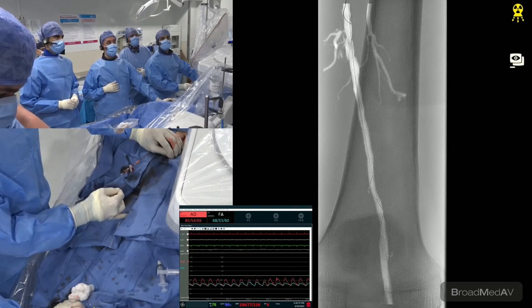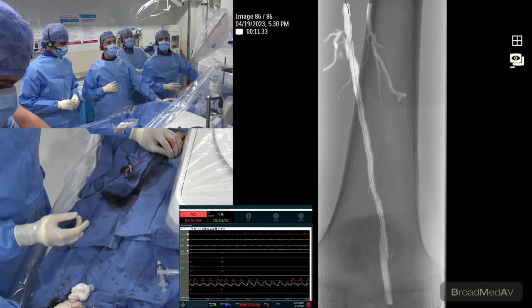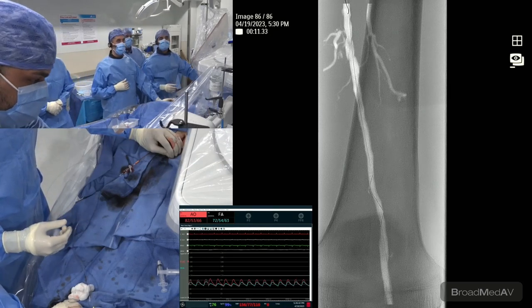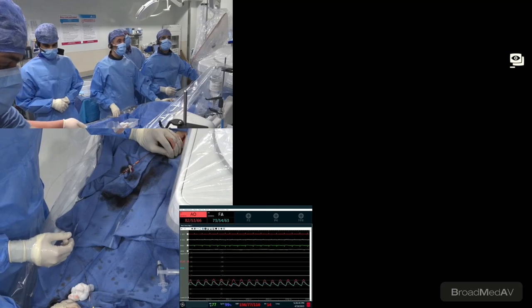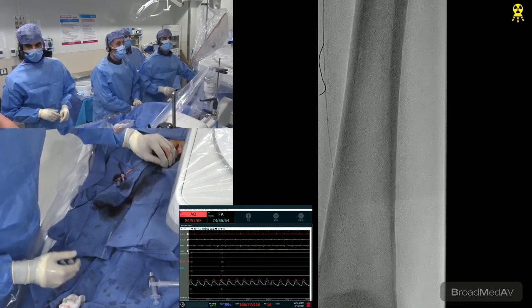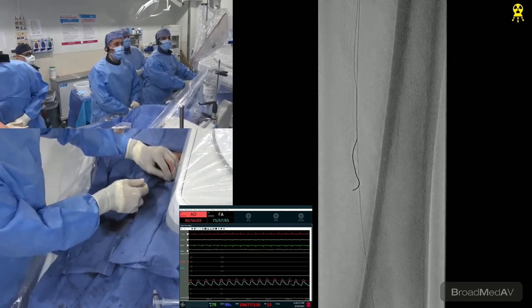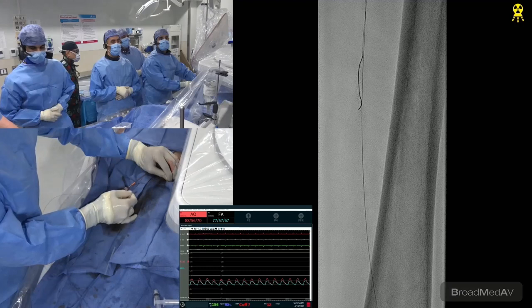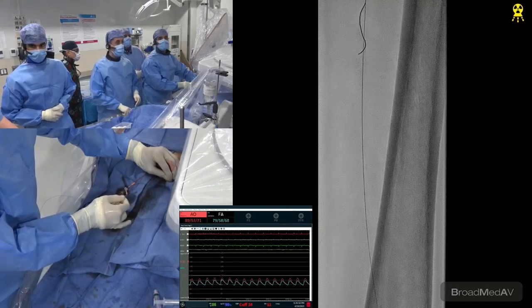And as you can see, if it clears right there, okay, so improved. There, now it's dropped, but it's dropped to about 10 millimeters. Let's keep going until where it normalizes. A little higher up. Seven, yep, 14. Just keep pulling.